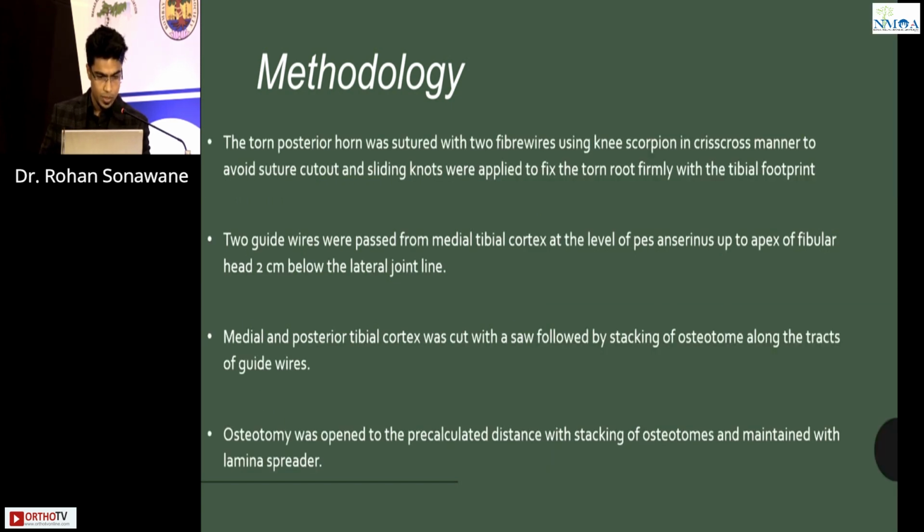The torn posterior horn was sutured with 2 FiberWires using a knee scorpion in a crisscross manner to avoid suture cutout, and sliding knots were applied to fix the torn root firmly to the tibial footprint.